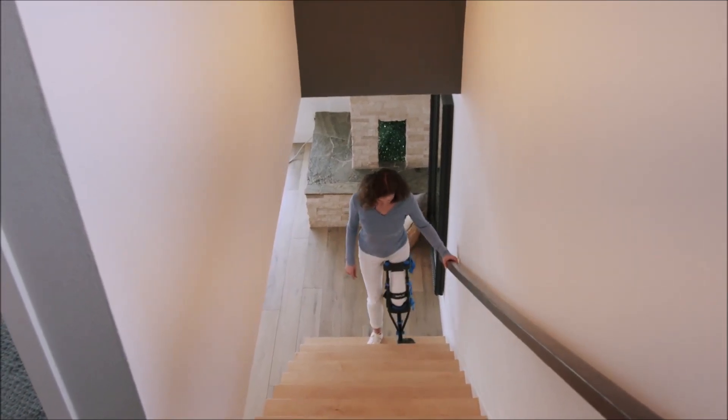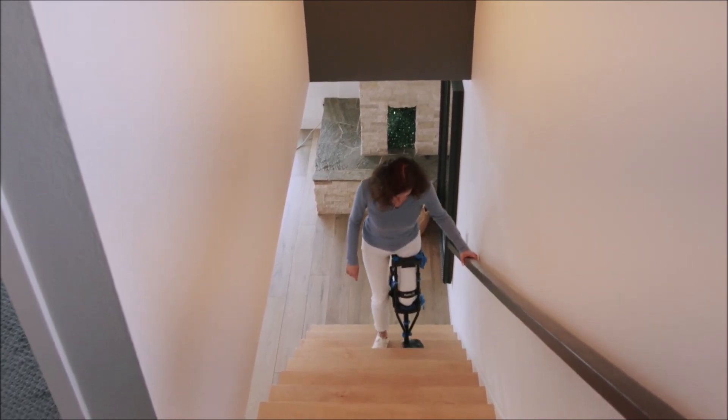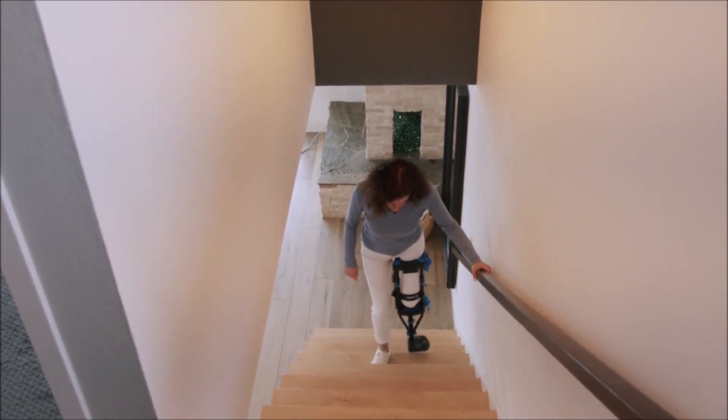One of the best things about the iWALK is that it allows you to use the stairs safely. When ascending or descending stairs, always use the handrail.